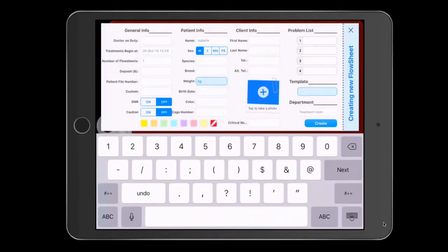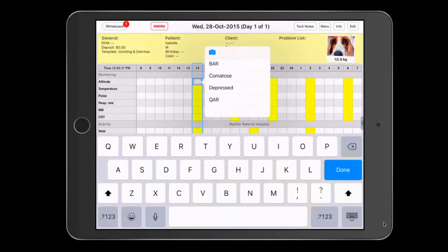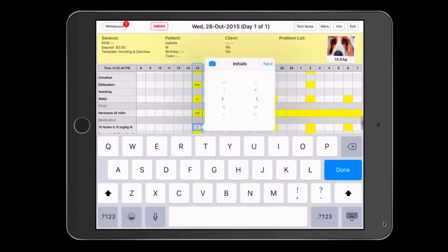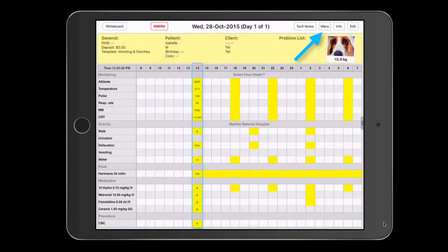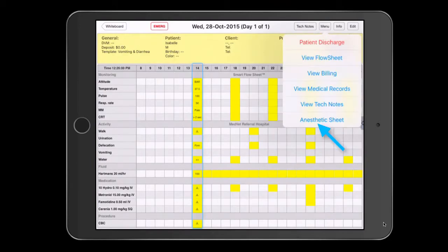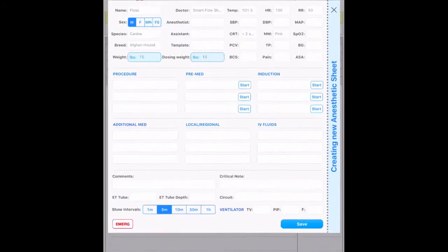You'll start by creating your patient on SmartFlow and completing their first set of treatments. Next, click on the menu and go to the anesthetic sheet. The pre-op page then appears.